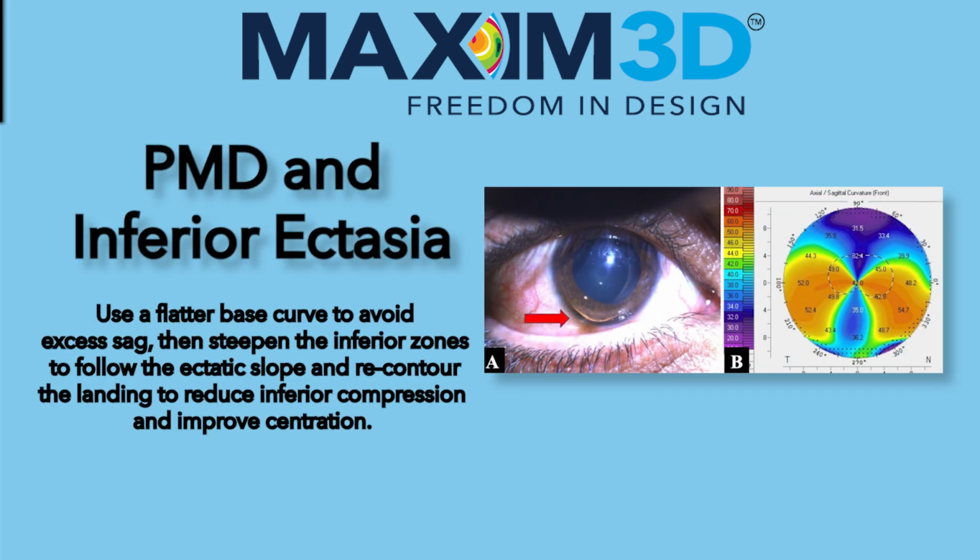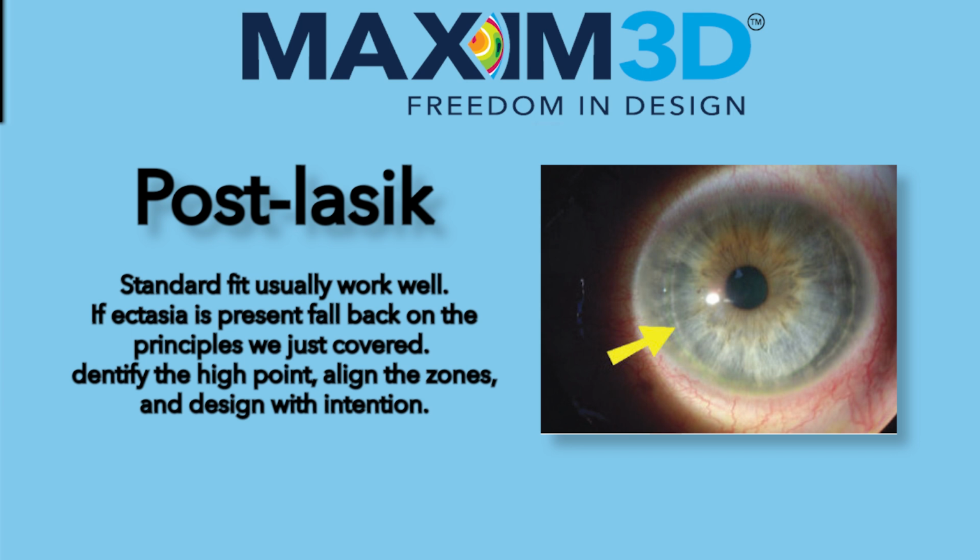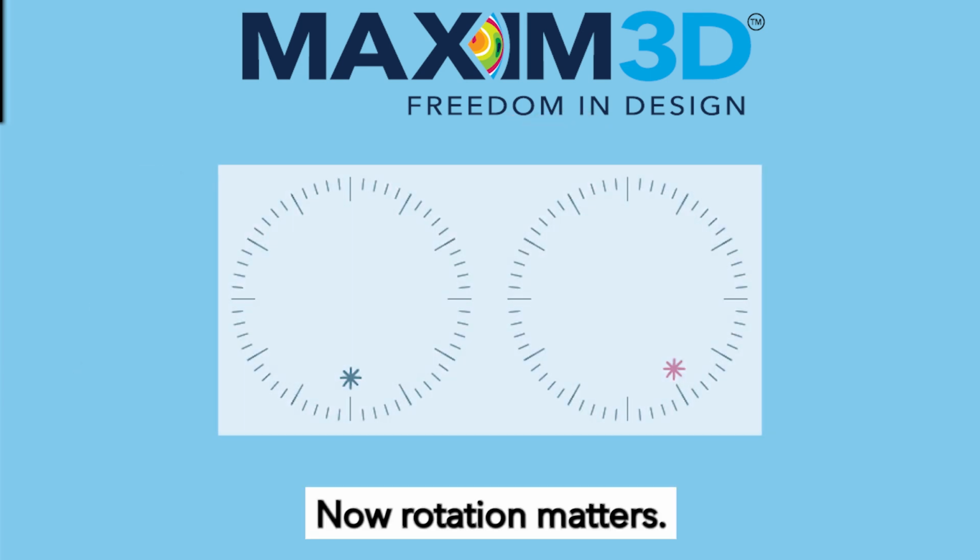PMD and inferior ectasia. Use a flatter base curve to avoid excess sag. Then steepen the inferior zones to follow the ectatic slope and recontour the landing to reduce inferior compression and improve centration. Post-LASIK, standard fits usually work well. If ectasia is present, fall back on the principles we just covered: identify the high point, align the zones, and design with intention. Now, rotation matters.